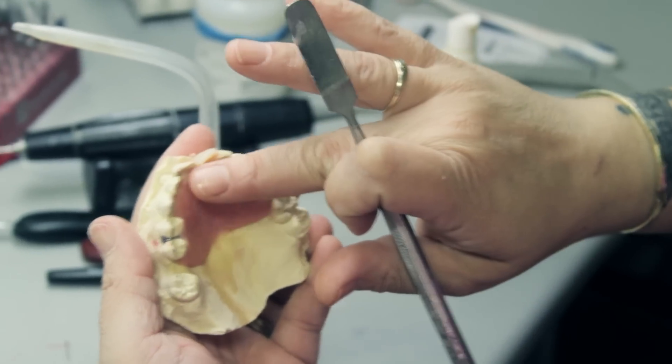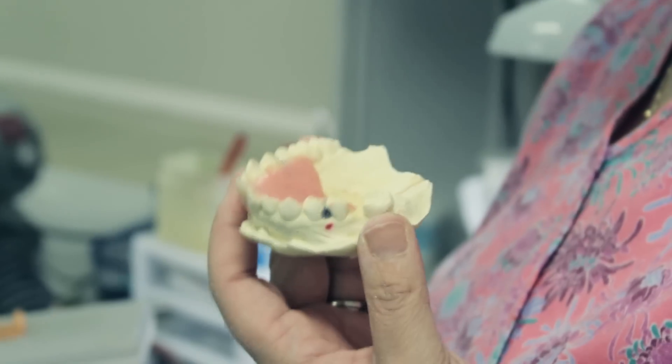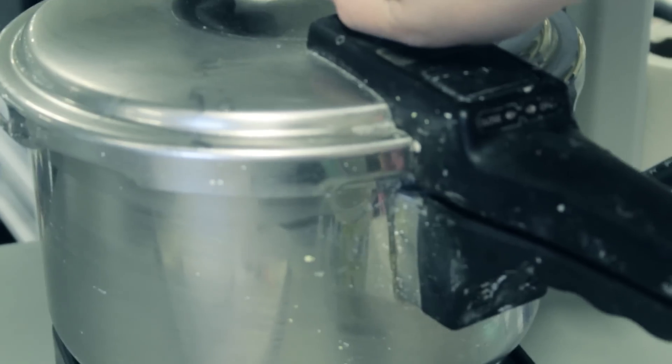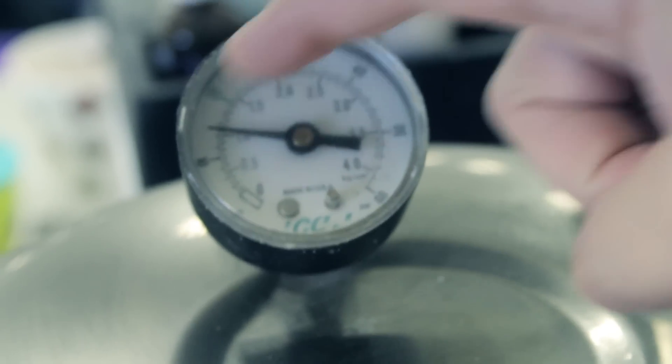Once my tooth has been positioned, one final look over — I'm ready for it to go into a pressure pot of hot water at 120 degrees, under 15 pounds of pressure for five minutes.